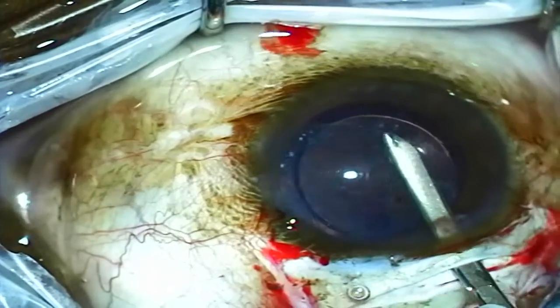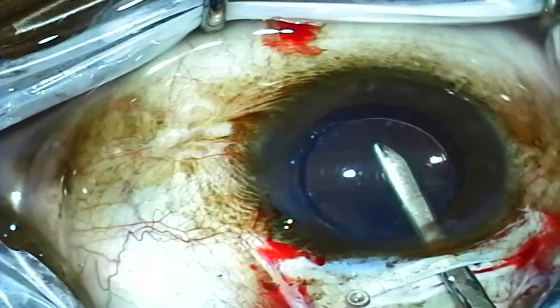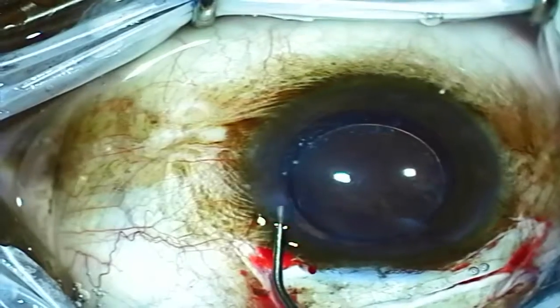I'm using the Simcoe to manually remove the remaining viscoelastic. Then the wounds are checked, hydrated, and the conjunctival peritomy is closed.